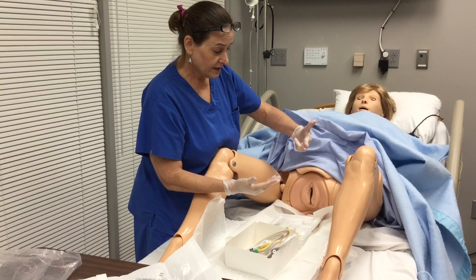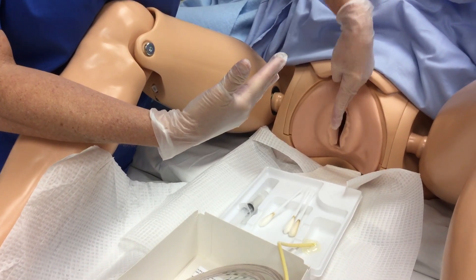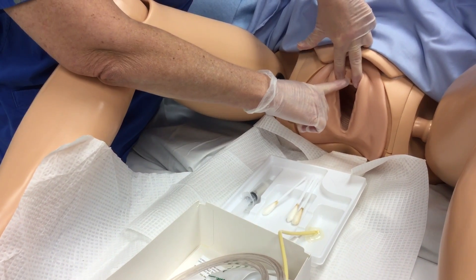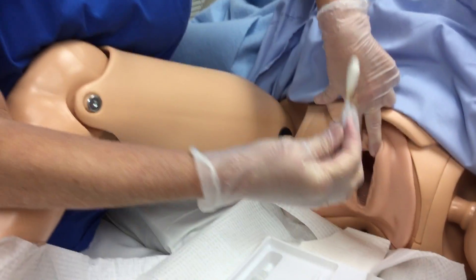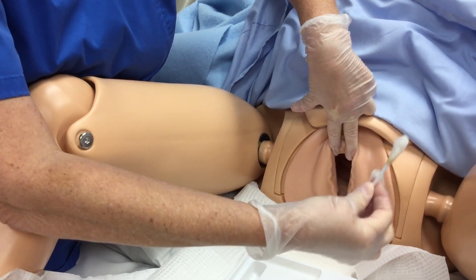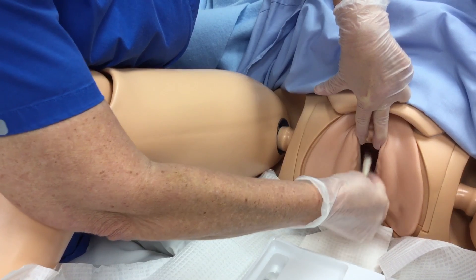You want to get two fingers between the labia minora. Be sure you get them deep in there between the minora, spread your fingers, and come way up to see your urethra. Remember, your meatus is going to be that top hole. When you prep, take each swab and just go straight down the middle over the meatus. The meatus is a small hole — you don't want to do one side then the other. You only have three swabs, so take each one and go straight down the middle.